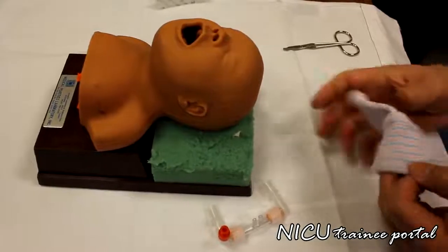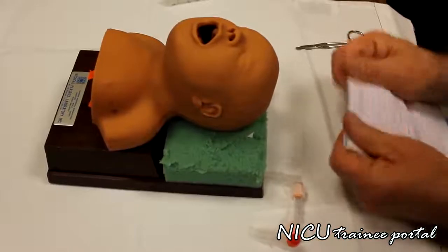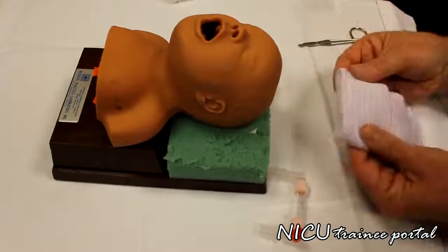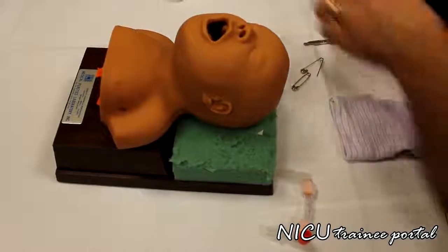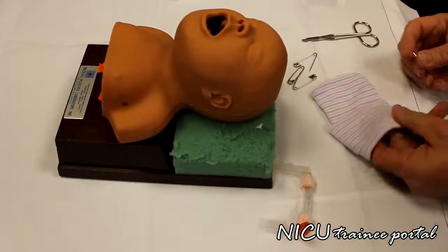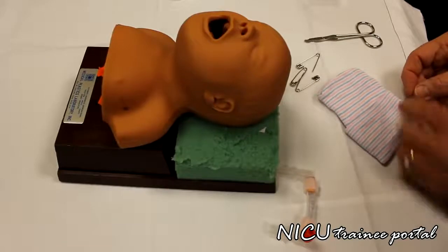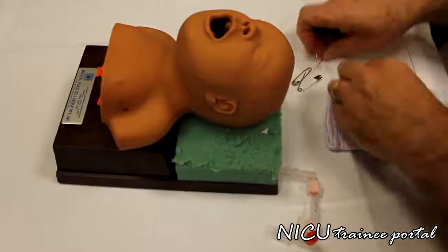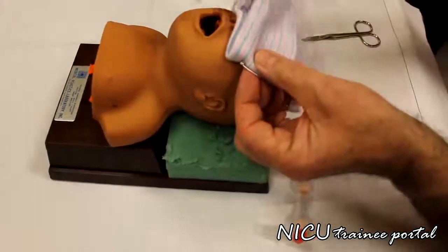I typically like to fold over. The hats usually fit the babies with the appropriate prongs. So we try to make probably a half or a third of the hat rolled over. And we take the 4 number 2 safety pins and we'll run them with our finger underneath, typically up a 1/2 inch from the edge, and try to grab as much as you can, and do the opposite side. And the opened end of the pin should be away from the baby's face.